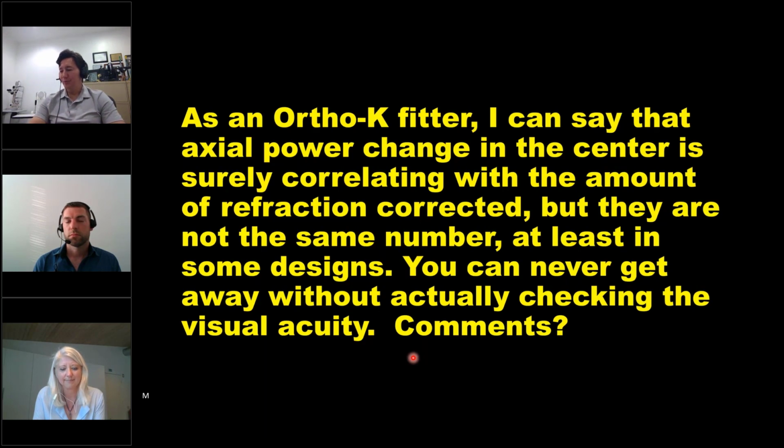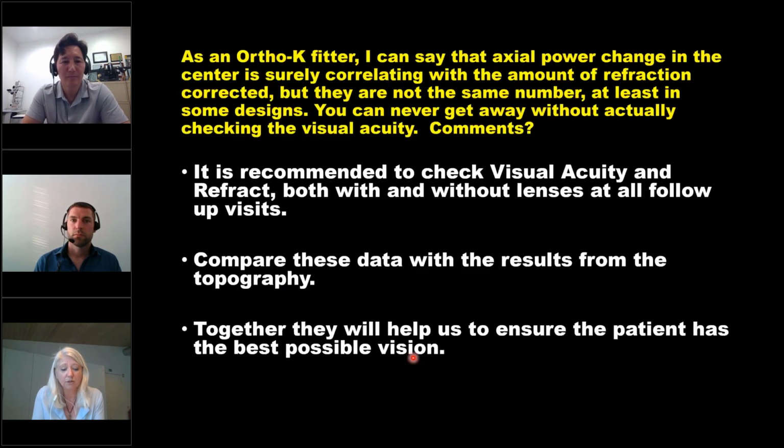Meta, could you provide some of your perspective on this one? Yeah, I totally agree. I always recommend to do both visual acuity check and refraction, both with and without lenses at any follow-up visit in Ortho-K. The subtractive map gives a very good and accurate measurement, which certainly correlates with the real outcome.